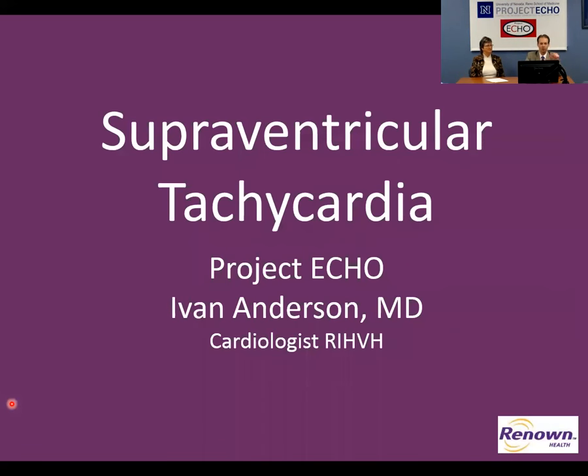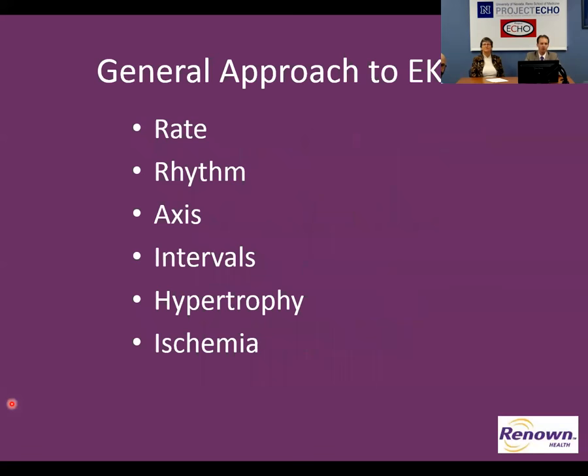Okay, so the talk for today is about supraventricular tachycardia. And again, I'm Ivan Anderson, one of the cardiologists with Renown. So before we get into the weeds with all this business of SVT, I just wanted to review that it's important to be systematic in your read of an EKG, and my general approach is rate, rhythm, axis, intervals, hypertrophy, ischemia. So if you're pretty systematic about that, then you're not going to miss things.